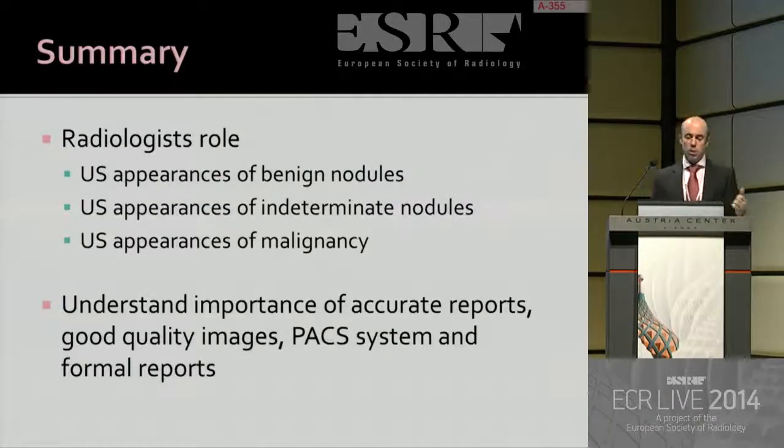We need to understand benign nodules, indeterminate nodules, malignant nodules, and their ultrasound appearances, and we really need to understand the importance of providing effective, useful reports allied to pictures on a PACS system, and this is the only way we can provide effective audit and follow-up and demonstrate our expertise.